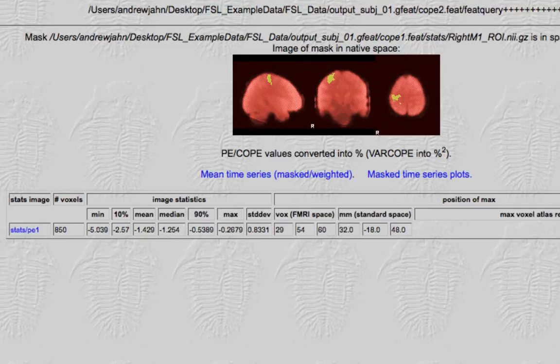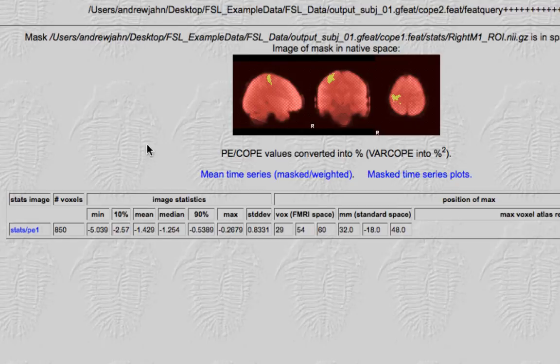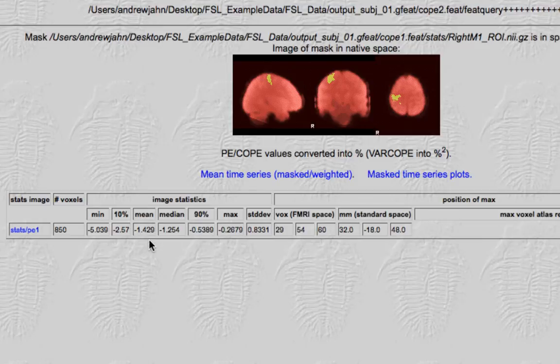Now, if you look at the other pop-up in the browser, this is for the contrast of right minus left. And remember that the contrast had the opposite weighting. So, not surprisingly, the mean and all the other statistics are the inverse of the other contrast.